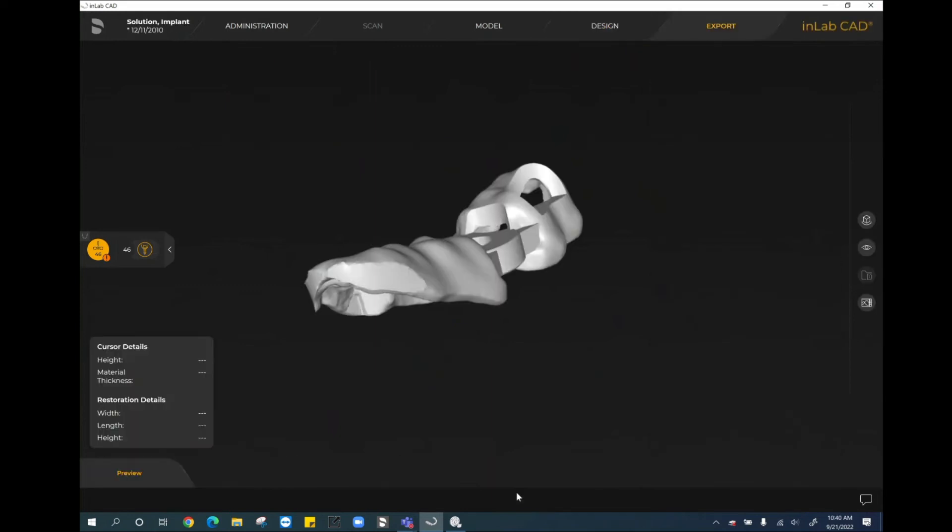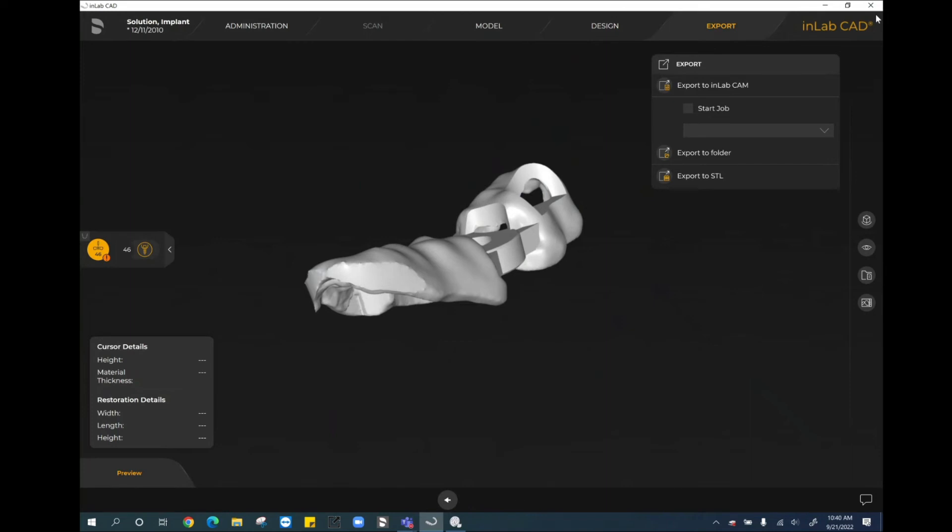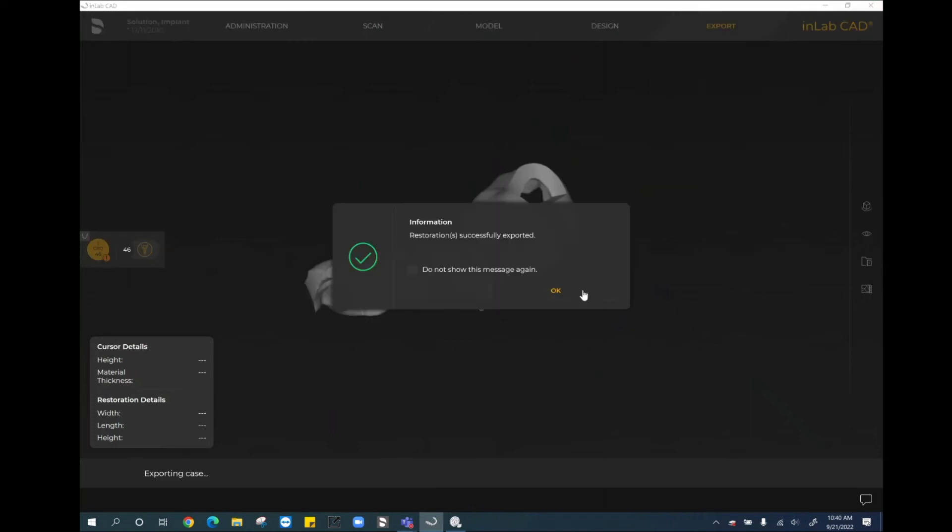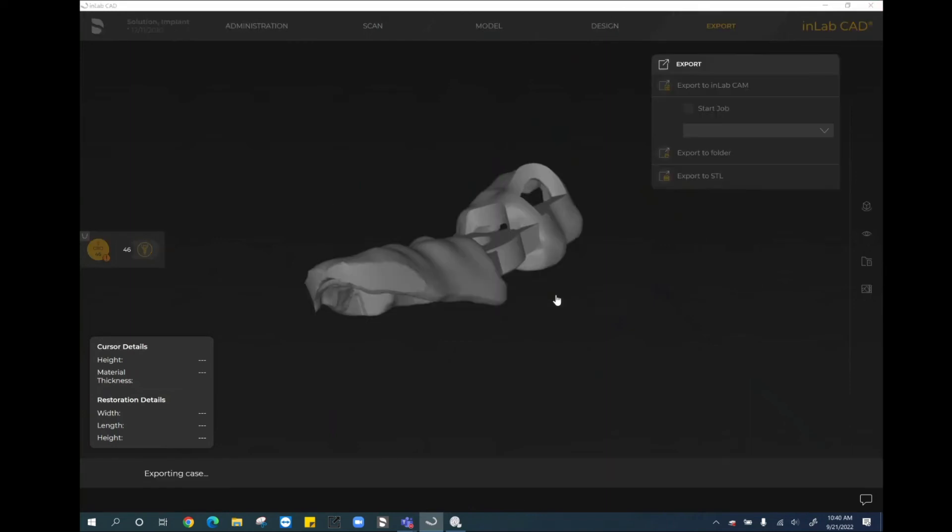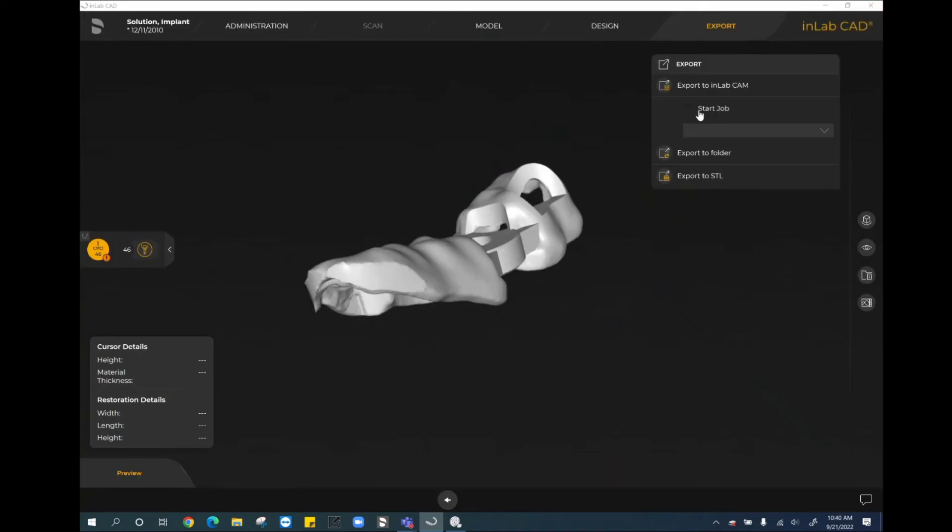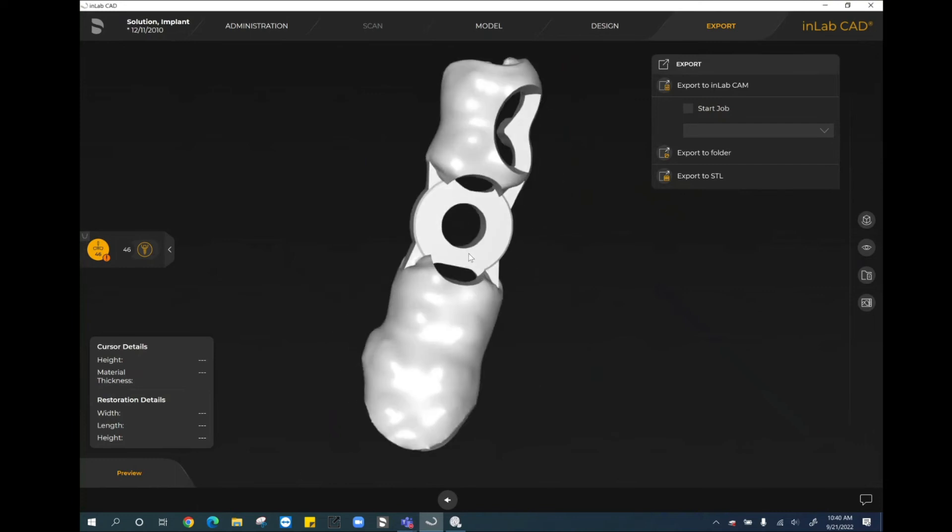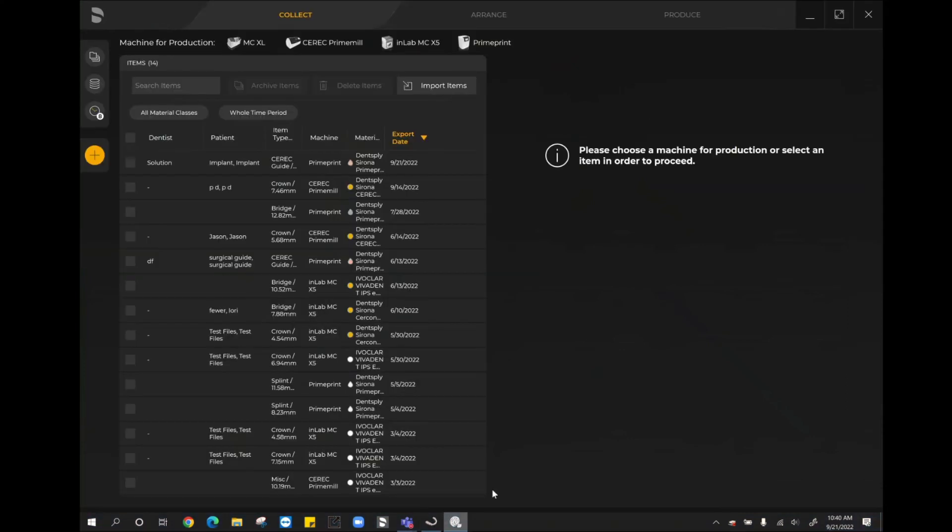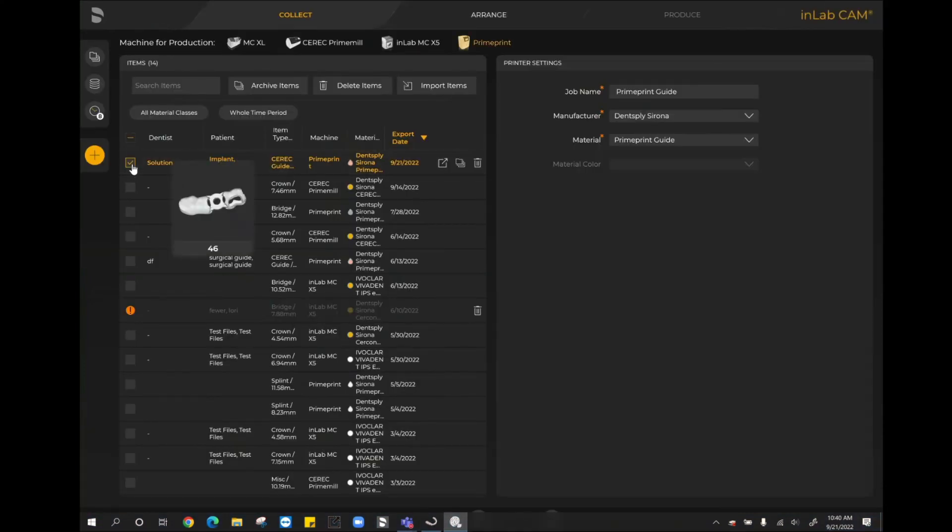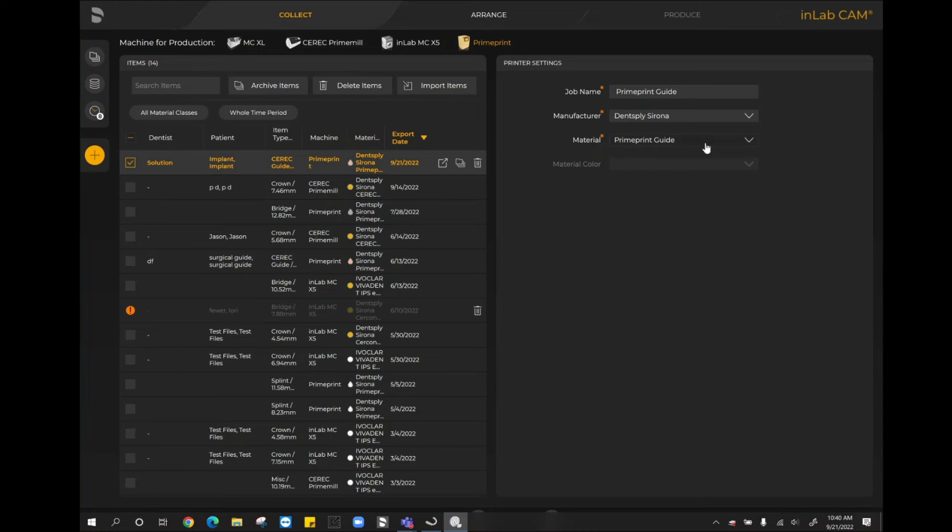When we move forward to the finalize phase, if you are using the Prime Print, you are able to export it directly to InLab CAM. You could also have selected the start job option. If you wanted to hit start job, you can identify that you want the job to start right away in the printer and basically getting it prepared in the CAM software. It would just require a little bit of confirmation and hitting start on the printer. However, I selected export to InLab CAM. So now when I open up my CAM software, I can see here on my first option here, this is the case that I just exported to myself. And again, it automatically knows that I can move forward with the Prime Print guide material.